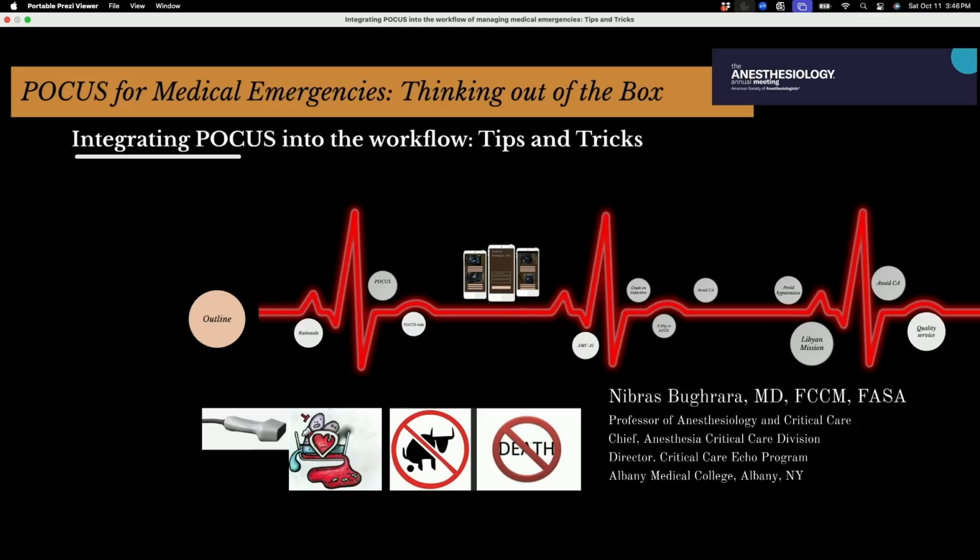If we're trying to make an entry point which is complicated, where you have multiple views and you have to ascertain when each view could be used, what the limitations of each view are, and then the time investment for your exam, spending like 15 or 18 minutes trying to get all the views in every patient, this is going to put down any efforts. Even if you go to a workshop for 2 days, like the ASTRA workshops, the SCCM, when you come home, you're not going to bring it, because it takes a long time to do. There's a lot of things that you can misinterpret.